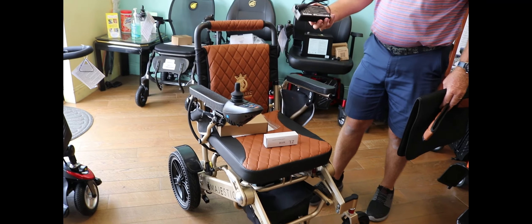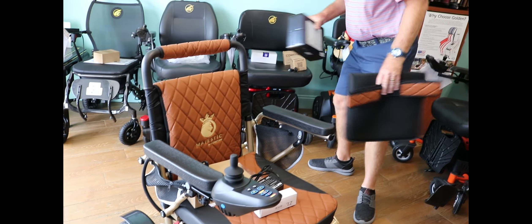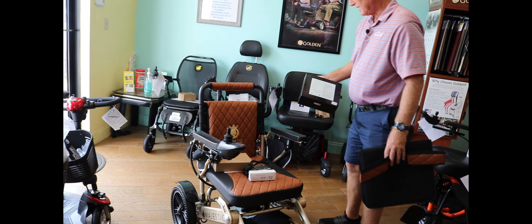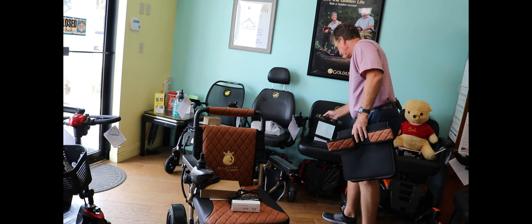It's a lithium-ion battery that goes right underneath. Here's a spare battery that's available with the chair, so you can see what the battery pack looks like. It's airline approved, so you can take this on a plane.